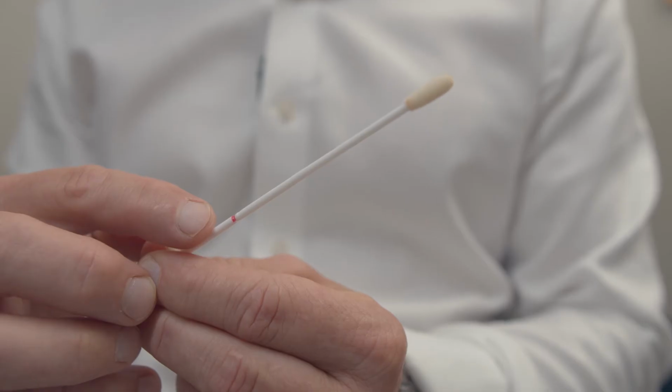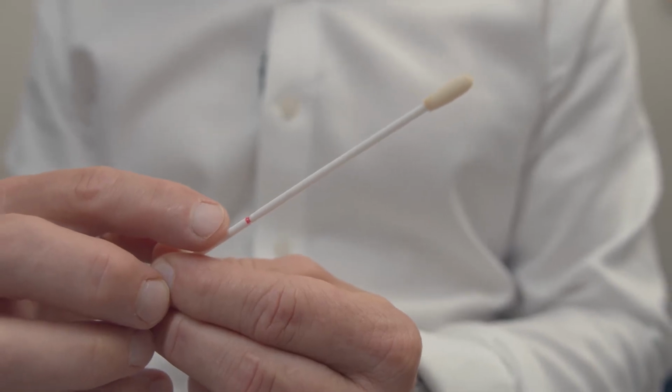There's your red mark. It's also scored so that you'll be able to break it in the collection container. You don't want to touch anything forward of that. If you inadvertently touch the tip to anything, you have another kit. Discard this and let's use the other one.